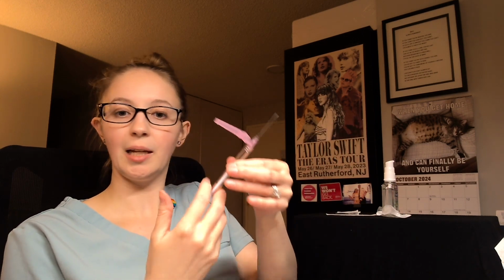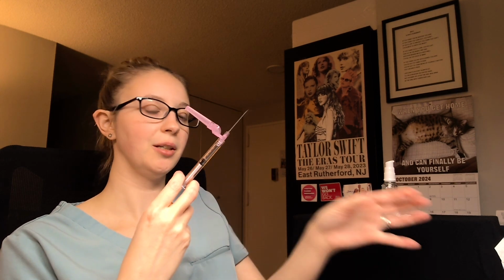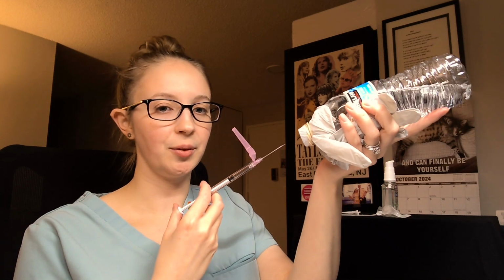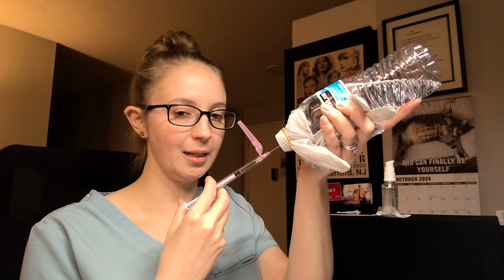So you're going to carefully uncap your needle. And then I usually like to hold it with my 2 fingers here and my thumb on the plunger. And you're going to pick up your medication vial. I usually like to hold mine upside down. You can play around with what feels the most comfortable. And you're going to pierce the rubber that you just cleaned off with the tip of the needle, like that.